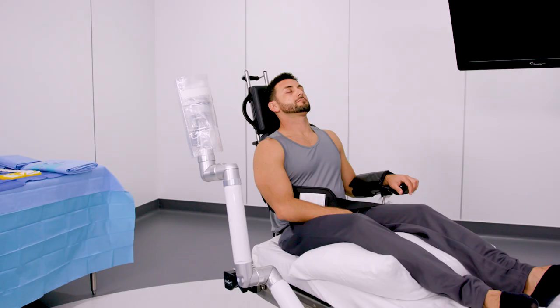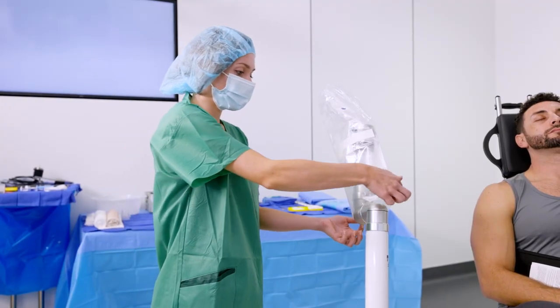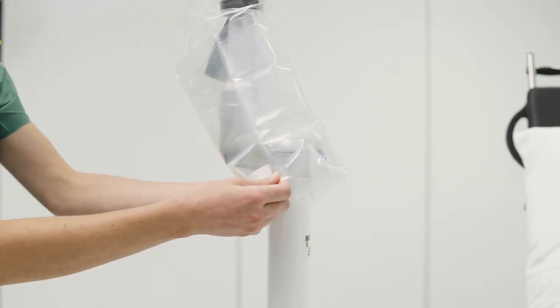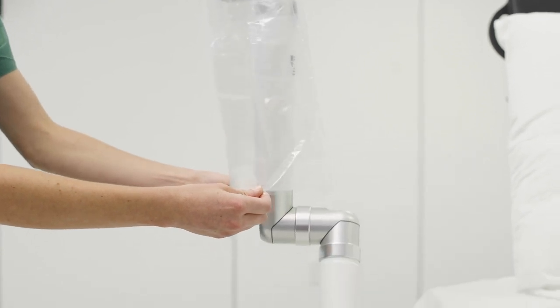With the support arm in the neutral position, fully extended towards the ceiling, hold the sterile sheath at the bottom and slide fully over the arm until the side rail is reached.